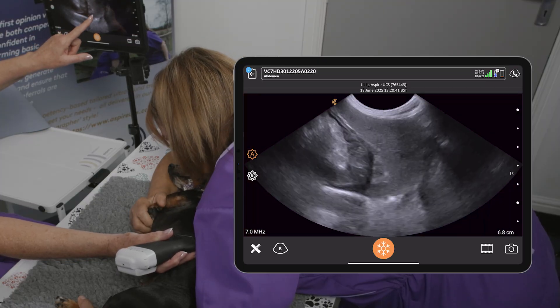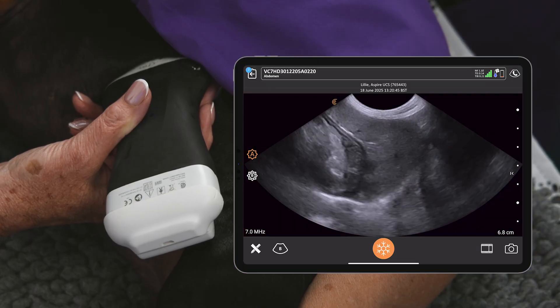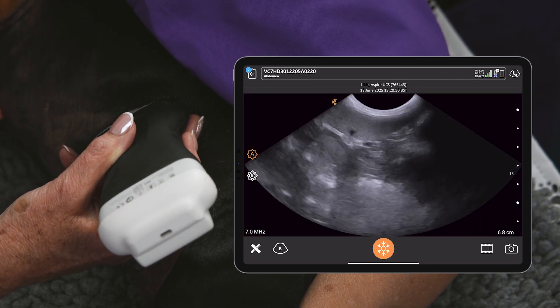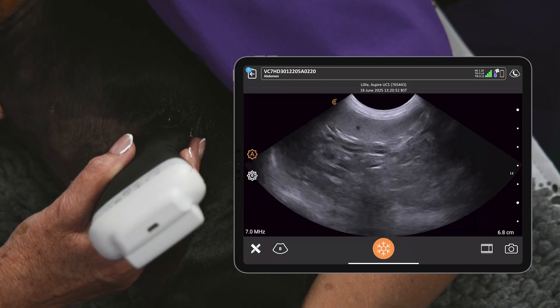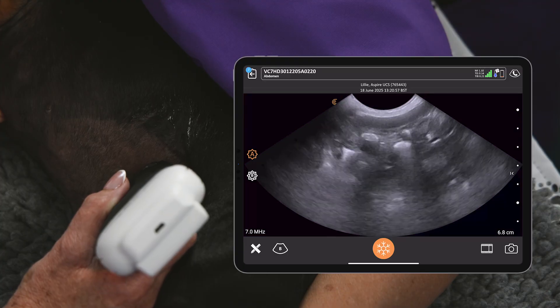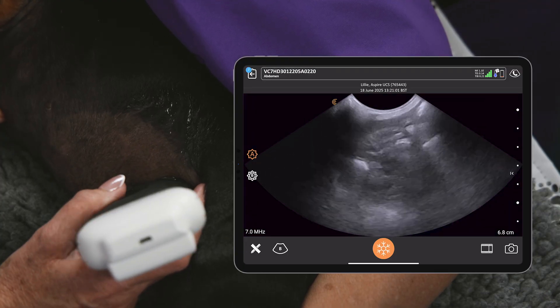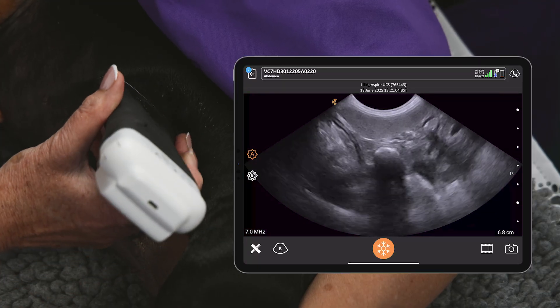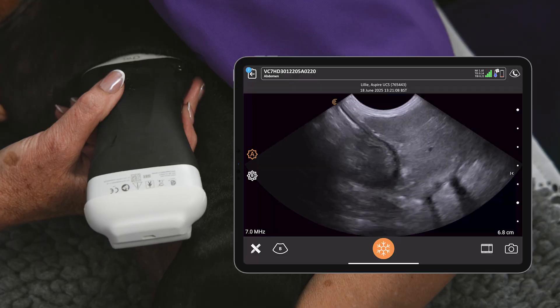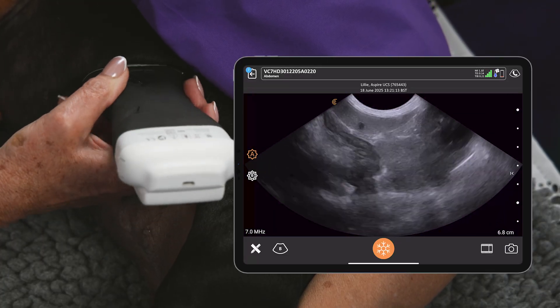Now looking at the spleen in short axis, you get this kind of backward C shape as you scan around here. I've just adjusted the depth — always optimize your image as you're going through different tissues at different depths. There's the spleen going up under the head in short axis, then we follow the body in short axis all the way down. The spleen is a lot bigger than you think. Always nice to get the diaphragm in as well — it's coming in up here — which helps prove there's no subphrenic collection on the left side.